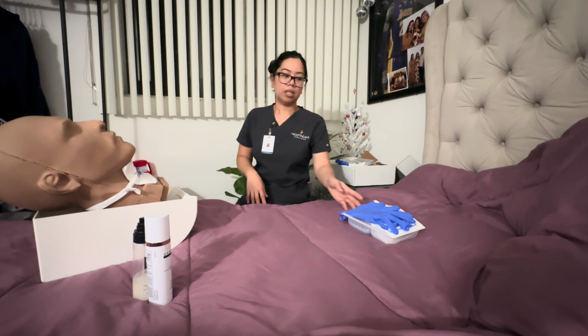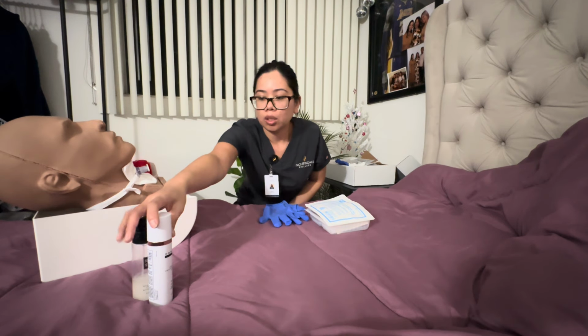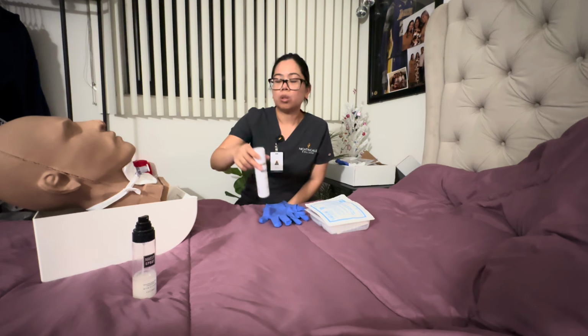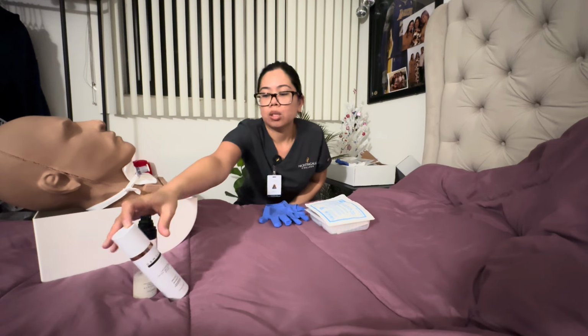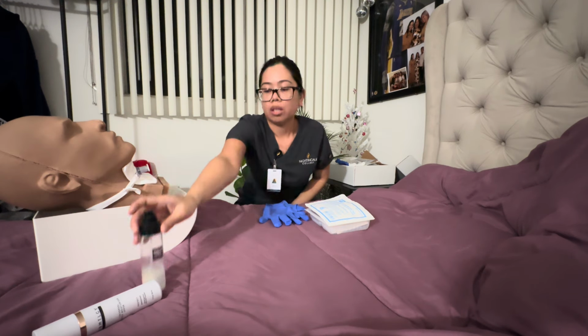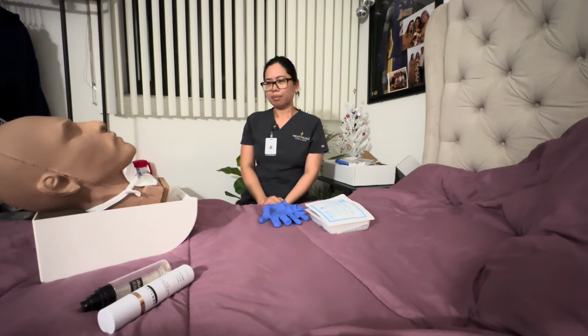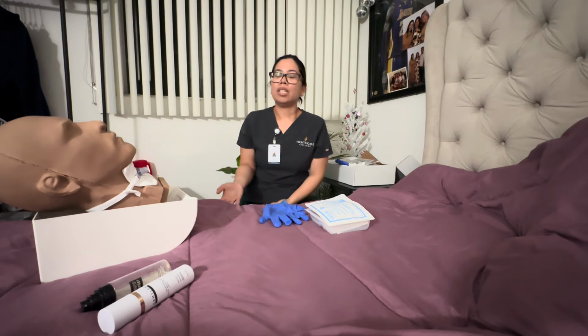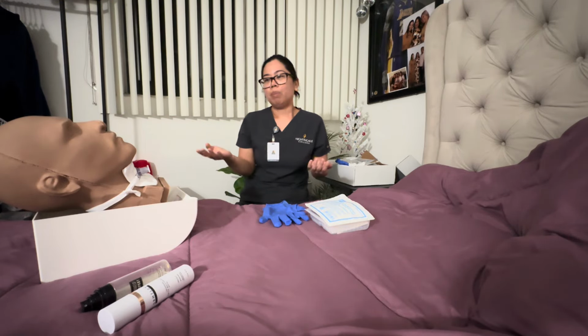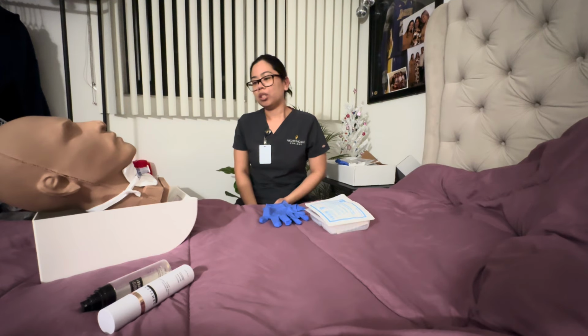For the purposes of this video, I have clean gloves over here, my trach kit. This is my sterile normal saline, and this one over here is the hydrogen peroxide. We have the patient who has a tracheostomy over here. I have the patient with the bed raised up and in a semi-Fowler's position.